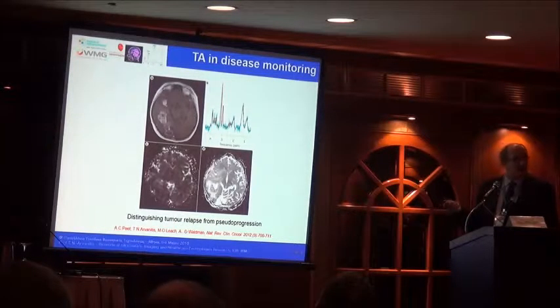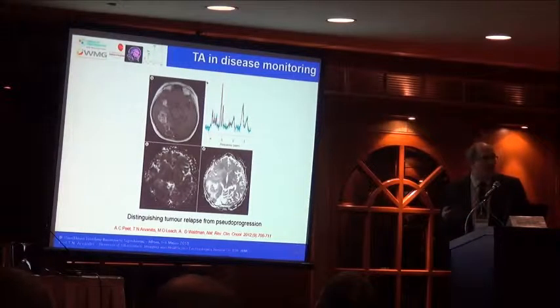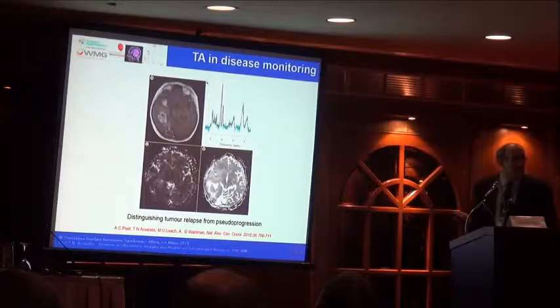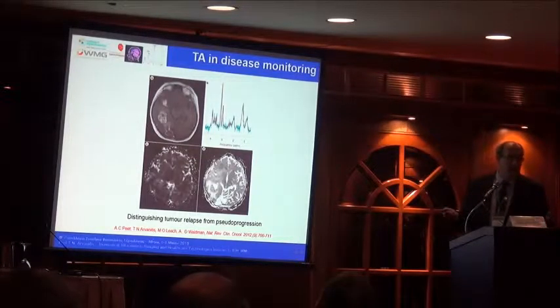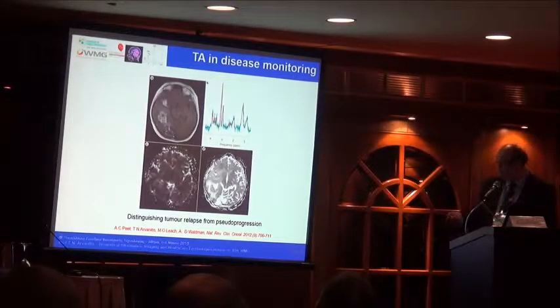Now, we have done this visually. We started doing this experiment with texture analysis, and our accuracy has improved quite a lot. Again, in that range, up to 80%. So it is very, very important in these cases where radiologists and oncologists have to make a decision: to go back to more aggressive chemotherapy, radiotherapy, or is this something that I should not worry about? Is it just pseudo-progression, or in the case of bad news, or is it something that says that everything's okay? So that's very, very important.